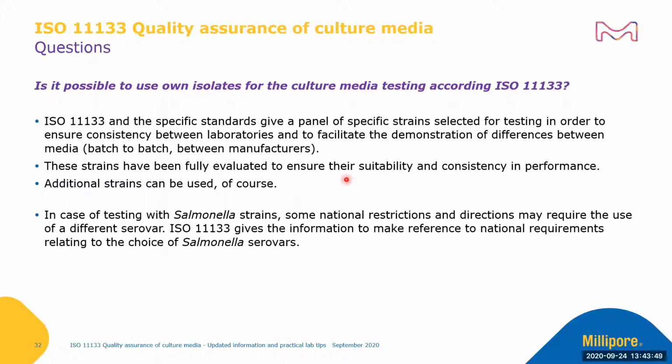These strains have been fully evaluated to ensure their suitability and consistency for performance testing. Additional strains can be used, of course. In case of testing with Salmonella strains, some national restrictions and directions may require the use of a different serovar. This possibility is given by ISO 11133.